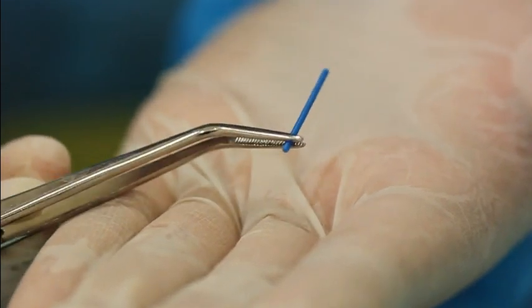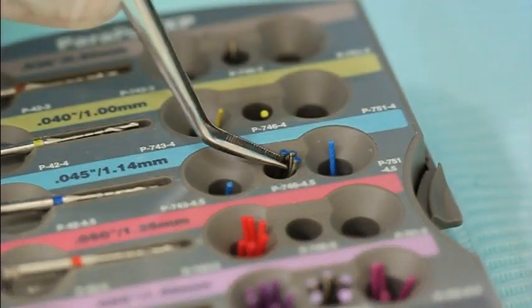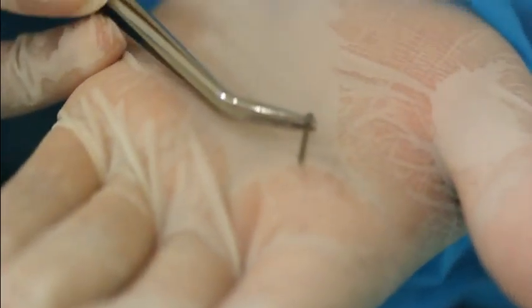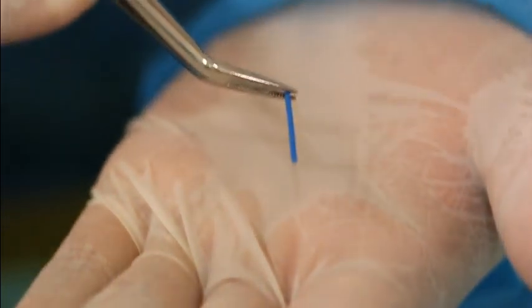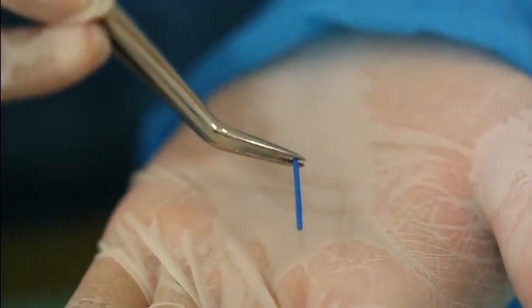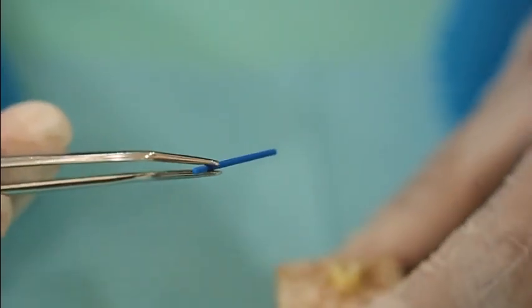The second is the temporary post. The third one is the burn out plastic post, which is used with one of the indirect methods as well.